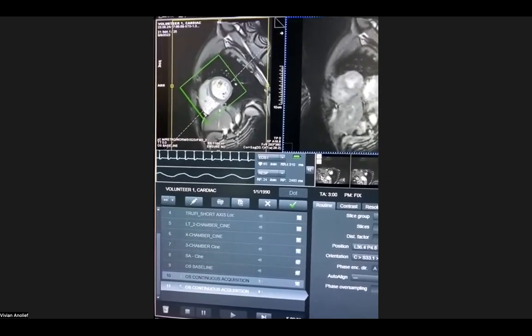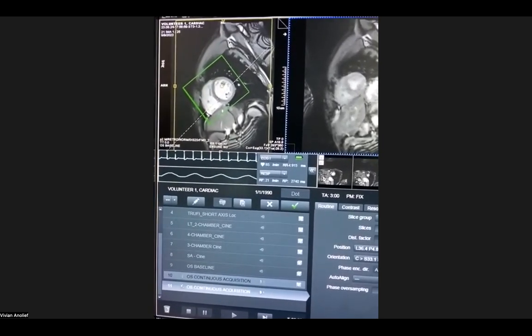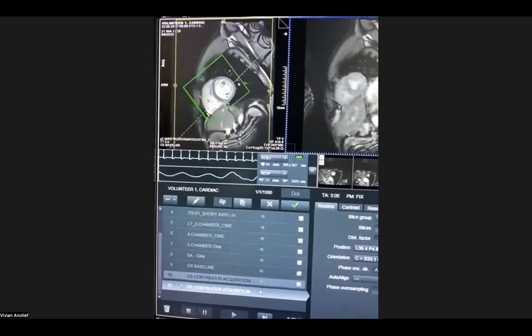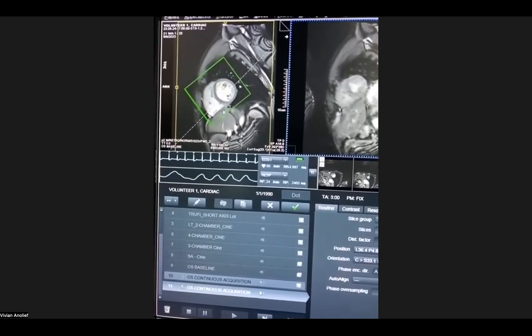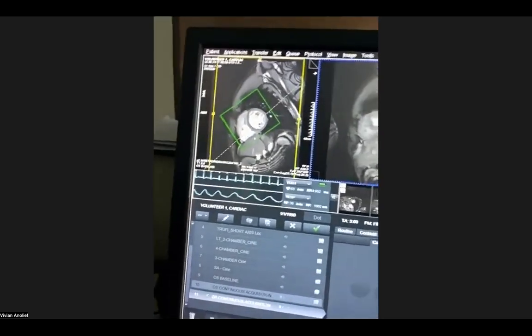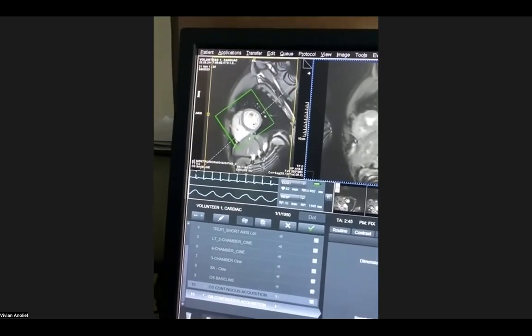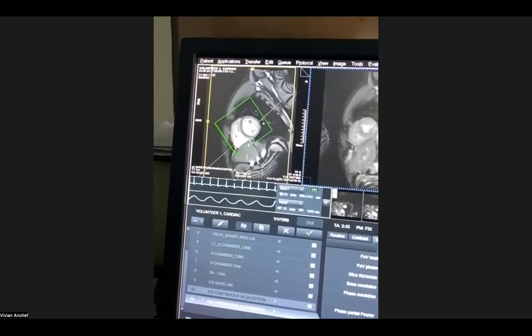So in my experience, I find it helpful to tell them that the breath hold should be 40 seconds because it gets them prepared to hold their breath for longer than 10 seconds, let's say. But the idea is just to get the patient to do it. So if you find that it's better when you don't tell them and they're managing to hold for 40 seconds, that's okay too. The idea is just to help them get there.